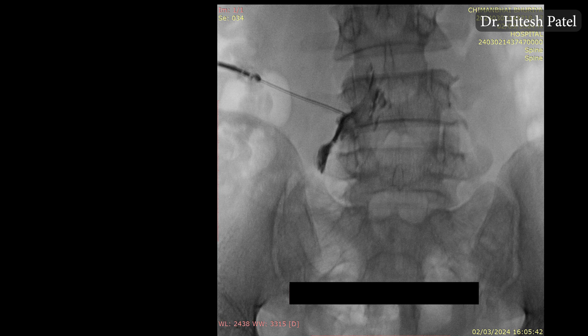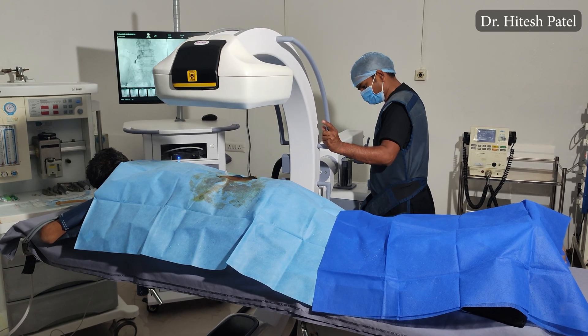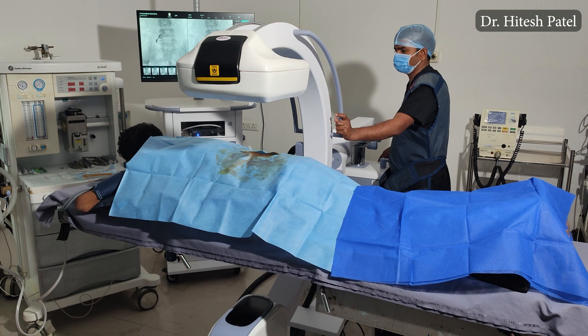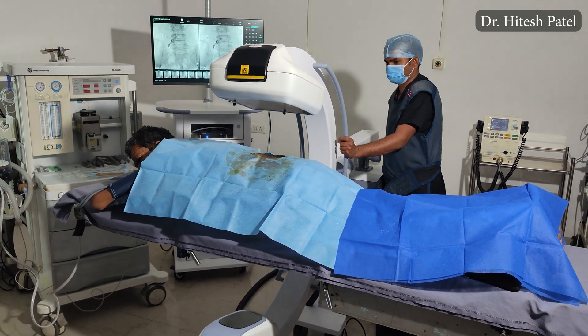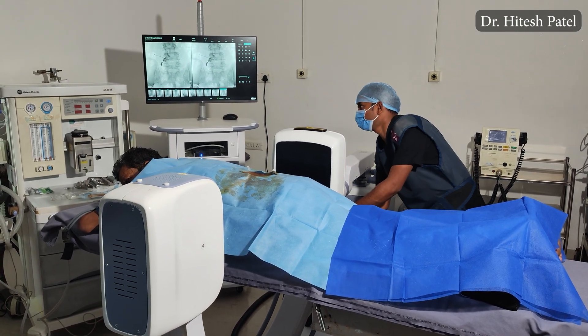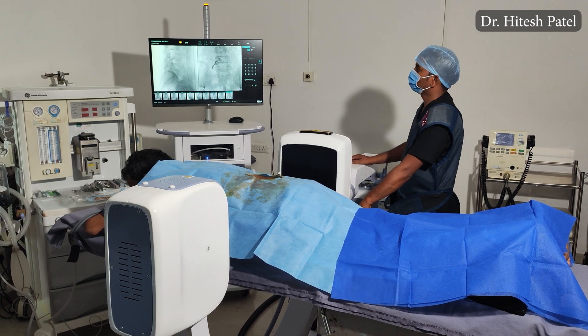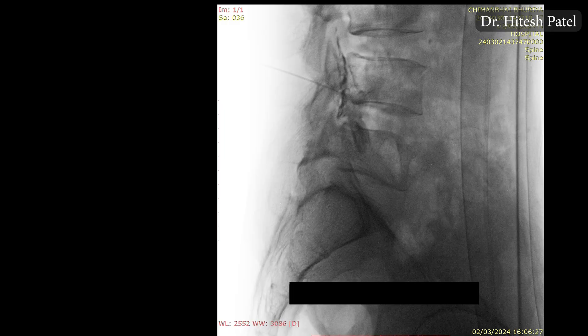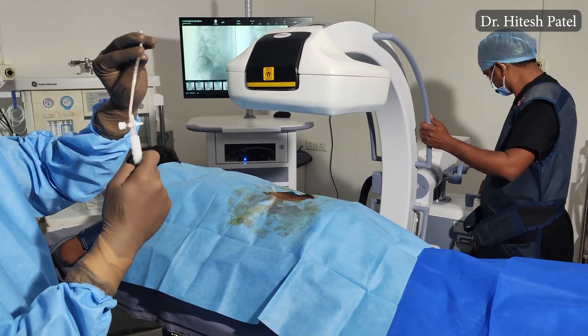After the AP shoot, we change the C-arm position to the lateral view to check the dye spread. In this lateral image, our dye spread is along the epidural space up to the L3-L4 level — a perfect spread. We have checked in both AP and lateral views, and now we are ready to inject our drug.